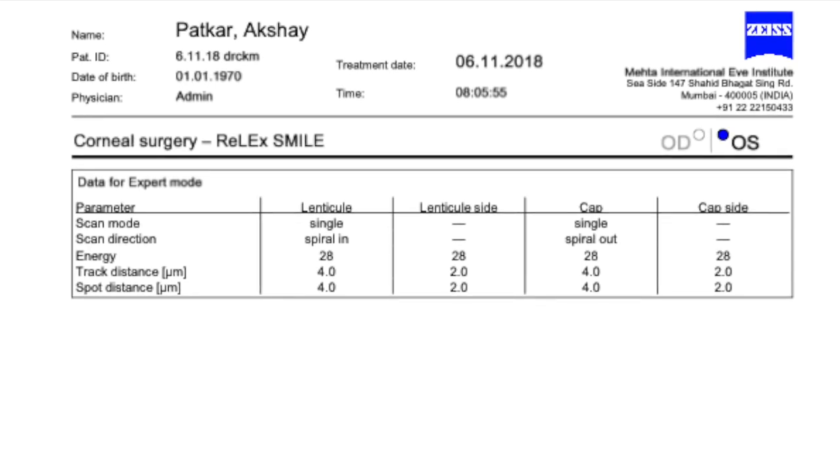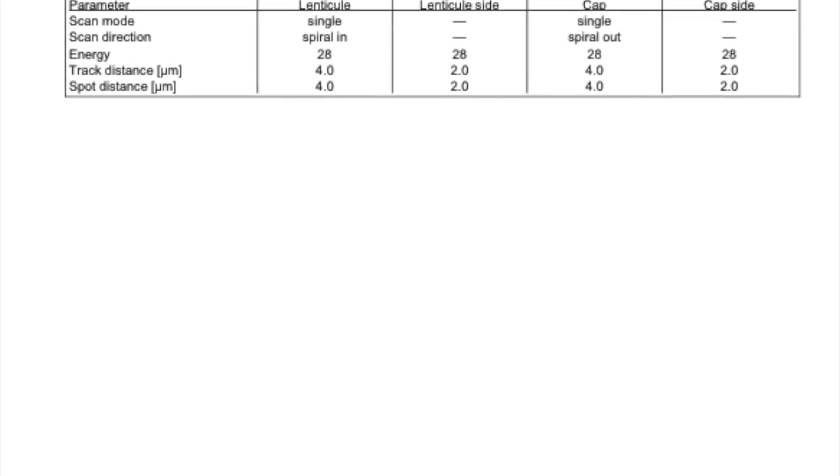We chose the largest cap diameter with the smallest interface, which is 7.7 mm, and an optical zone of 6.5 mm. The cap thickness is 120 microns. We were apprehensive that we may not be able to achieve suction on such a large and flat cornea.